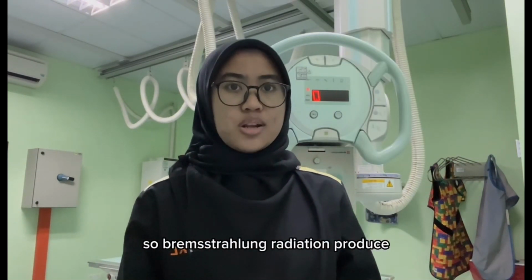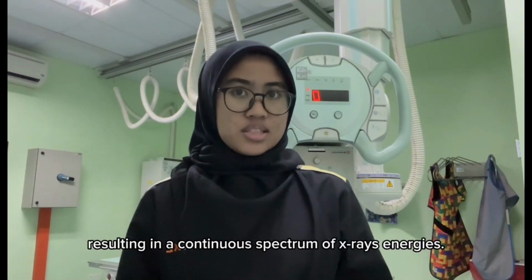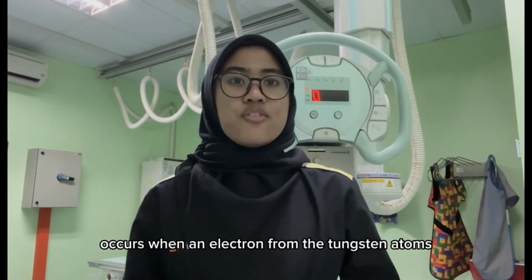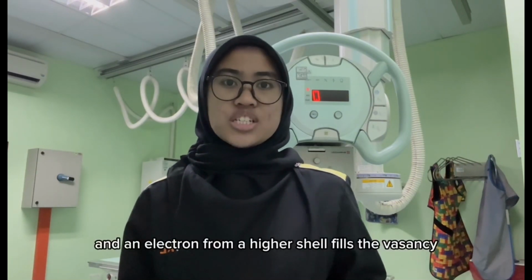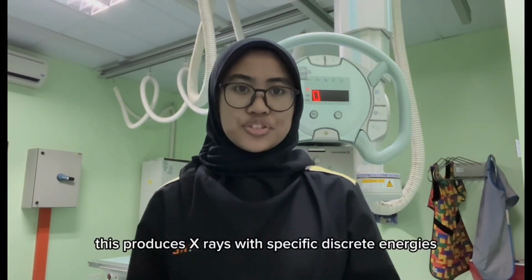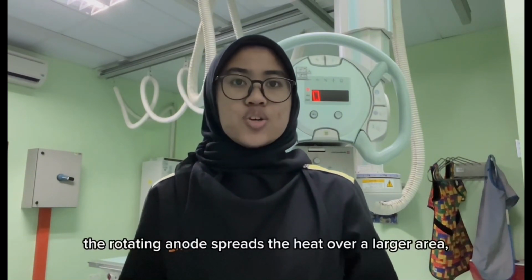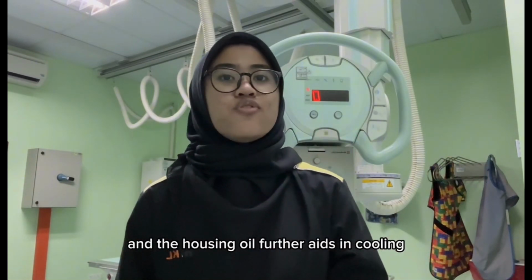Bremsstrahlung radiation is produced when electrons are decelerated by the nucleus of a tungsten atom, resulting in a continuous spectrum of X-ray energy. While characteristic radiation occurs when an electron from the tungsten atom's inner shell is ejected and an electron from a higher shell fills the vacancy. This produces X-rays with specific discrete energies. Lastly, heat dissipation. Due to the significant heat generated during X-ray production, the rotating anode spreads the heat over a larger area and the housing oil further aids in cooling.